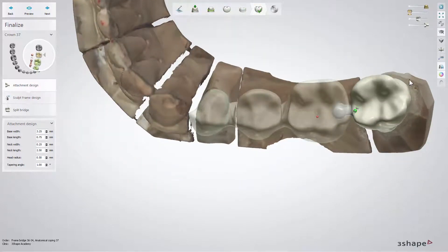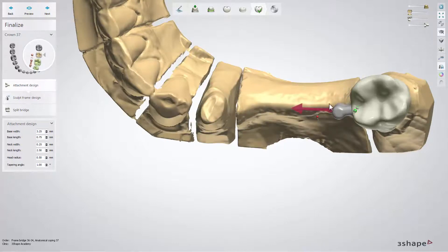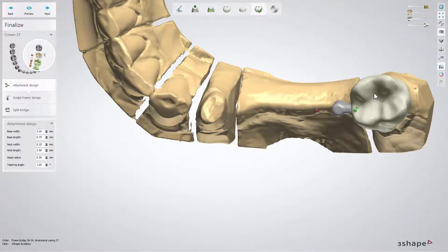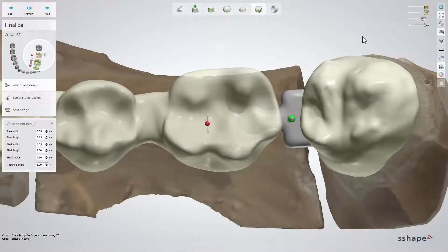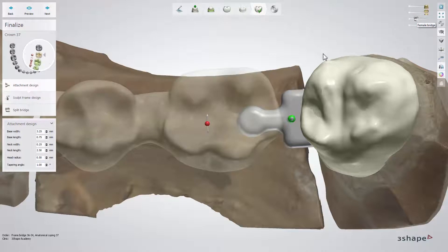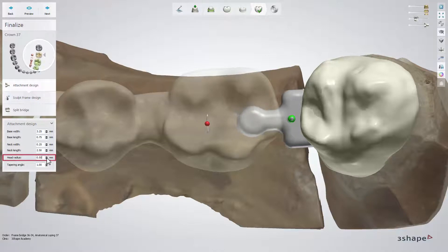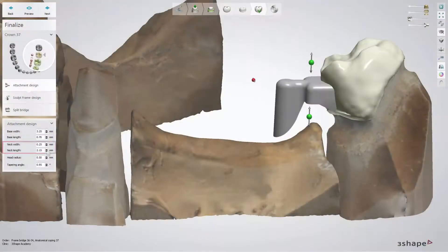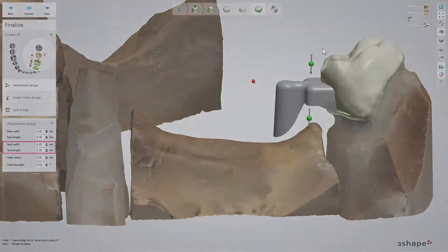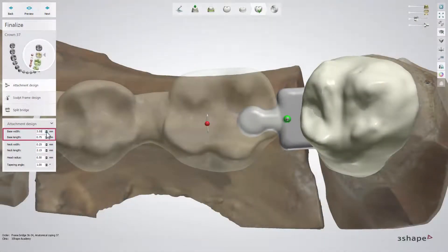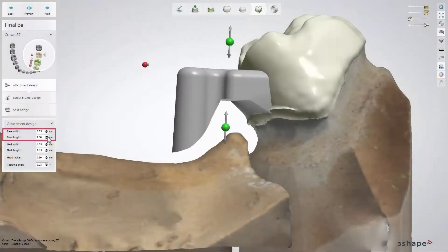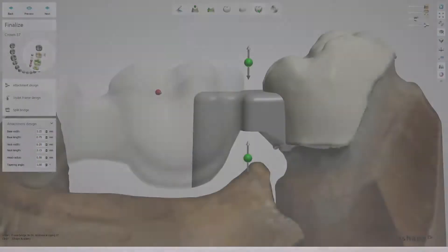For a stable structure, please make sure that the head of the attachment is placed in parallel with the alveolar bone. Using options in the menu to the left, you can change the shape of the attachment by modifying the following parameters: the head radius, the neck, the base, and the tapering angle.